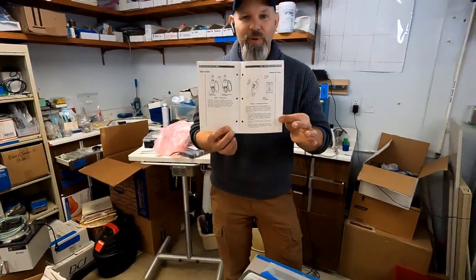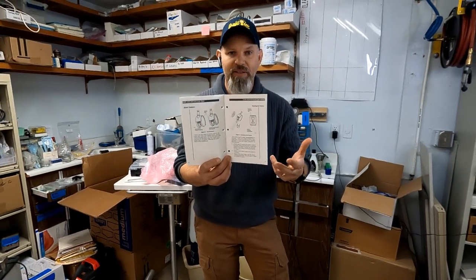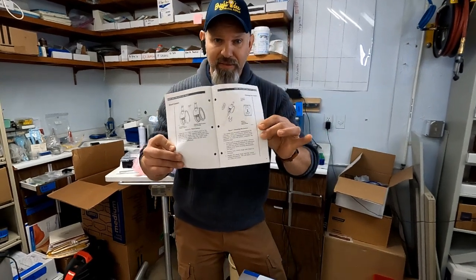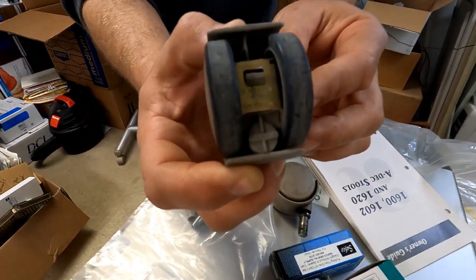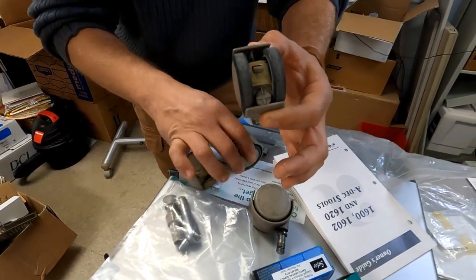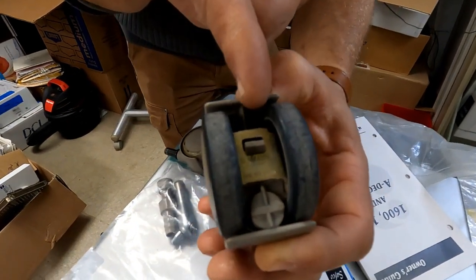So this is the reason why reading manuals is important, because this is going to give you ideas about things concerning the equipment that you didn't even know. So I'm going to show you right now. We're going to set this book down, and I'm going to pick up a couple casters right here, and I'm going to show you. This right here is actually the caster that the manual is referencing. Now, I will say not all casters have this feature. But the point is that you're supposed to be able to move that little clip.